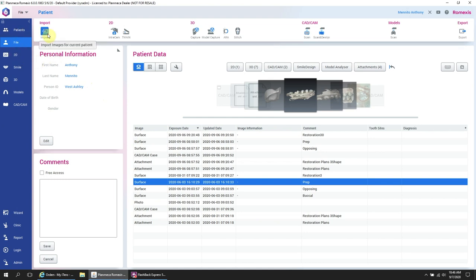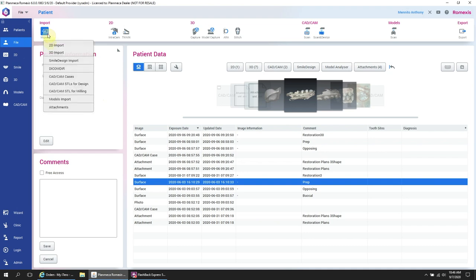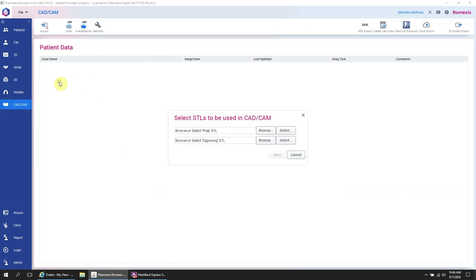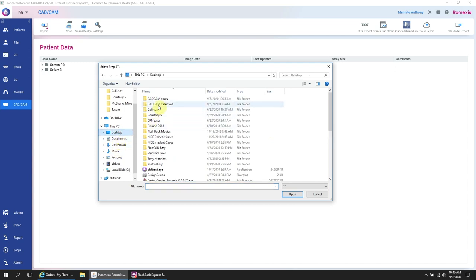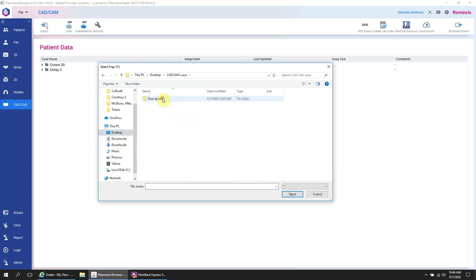And you can see the import button there at the top left. You hit import and then you hit CAD CAM STLs for design. It will bring up this window. And you see they're labeled as prep and opposing. And this is really important to note because in this case, it's not maxillary mandibular. It is prep and opposing. So in this case, the prep is the lower arch.